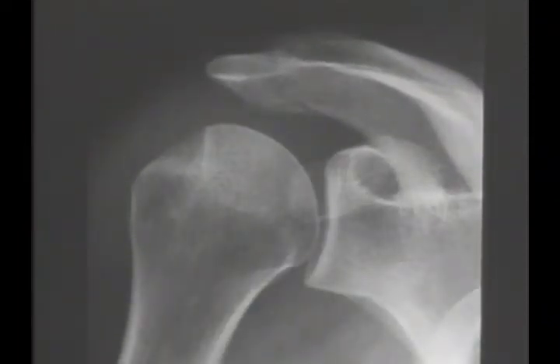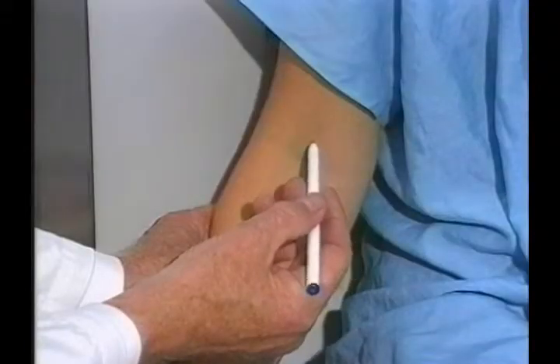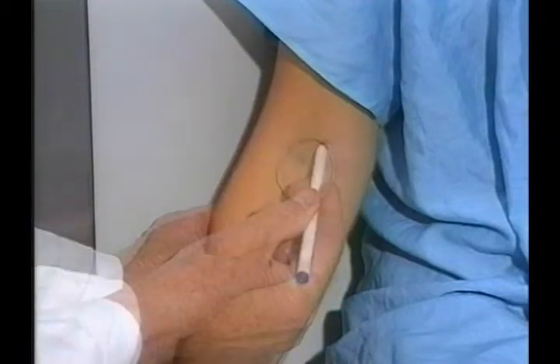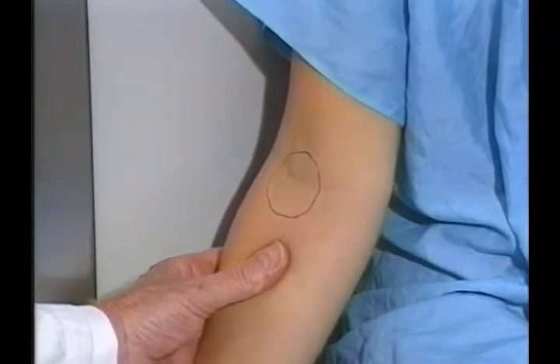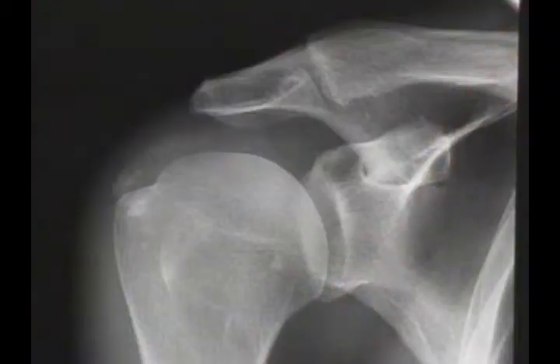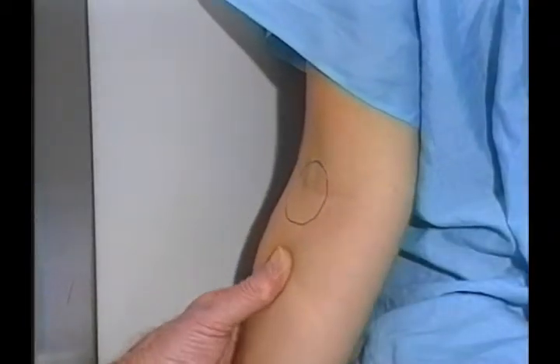Now let us study a second important element of the shoulder examination, rotation of the humeral head. Here it is in the neutral position. The tuberosity is not preeminent, and there is a risk of missing lesions because the elbow is facing forward. I turn the elbow slightly in external rotation. The tuberosity, A, is nicely profiled, and the lesser tuberosity, B, lies lower in front. This is the proper routine position.